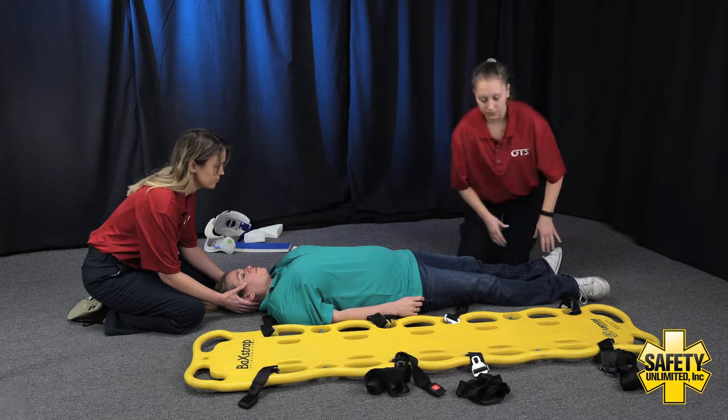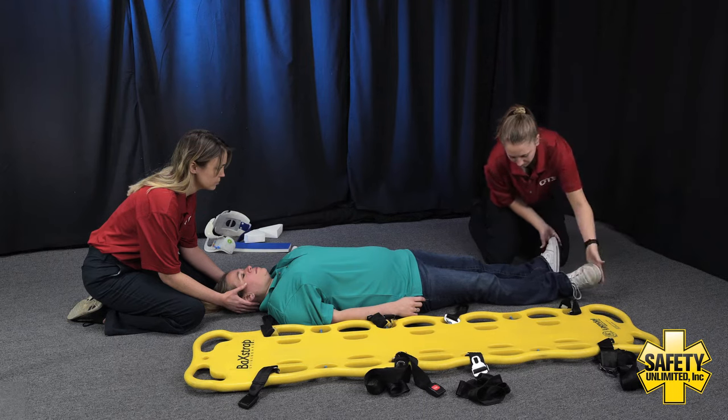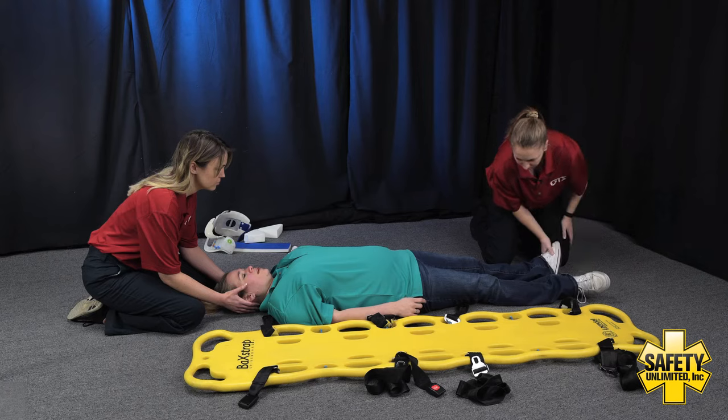Down to the lower extremities — we would take off the shoes. We're going to check for those pedal pulses. Present and equal bilaterally. Patient, can you go ahead and pull up on my hands for me and push down? And can you tell me which foot I'm touching? And which foot am I touching?